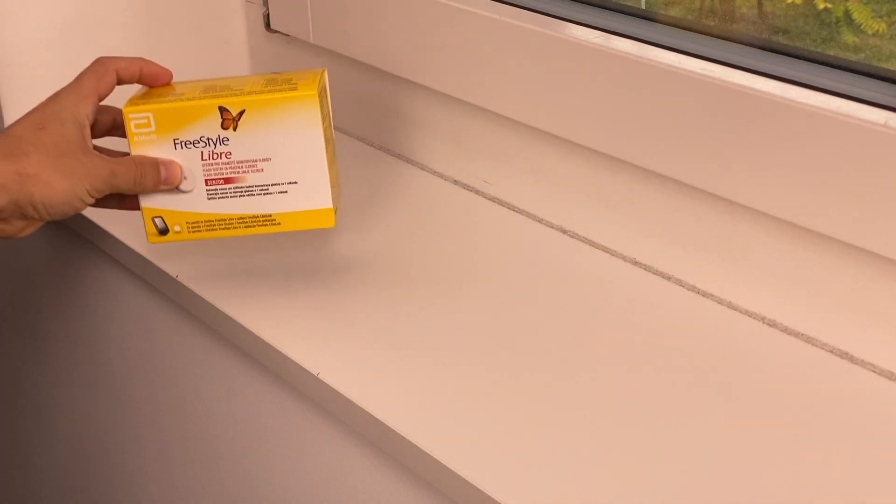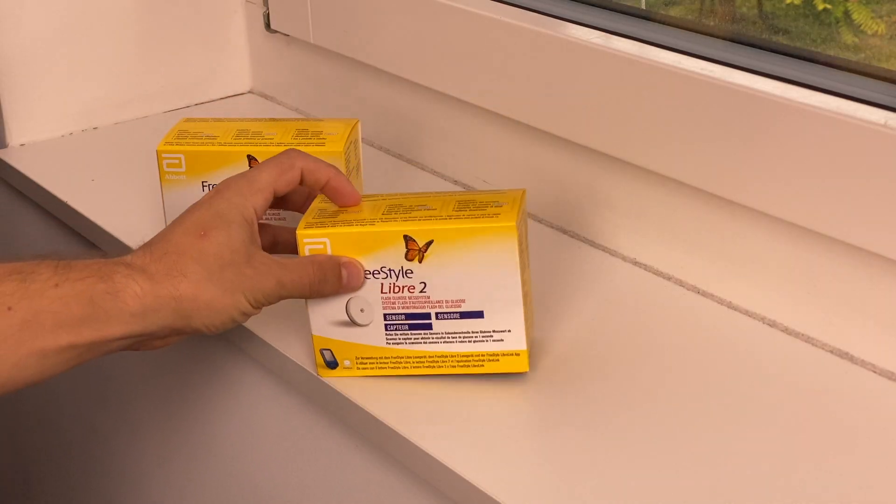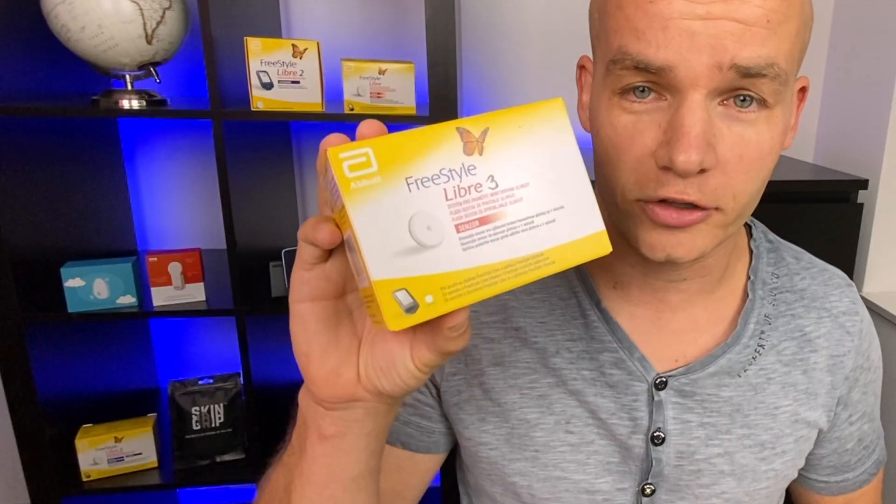Freestyle Libre 1. Freestyle Libre 2. Freestyle Libre 3. That's right! A totally new version of Freestyle Libre — Freestyle Libre 3 — will become available in the next few months. And here is how it's actually not going to look like. It's not going to look like this at all, because it's totally different. In this video, I'm going to talk about how Libre 3 is different from Libre 2, what new features it has, and when you can start using it. So scan your sensors and let's go!